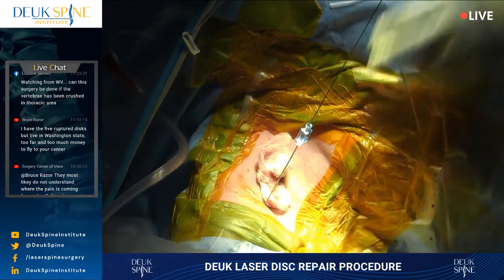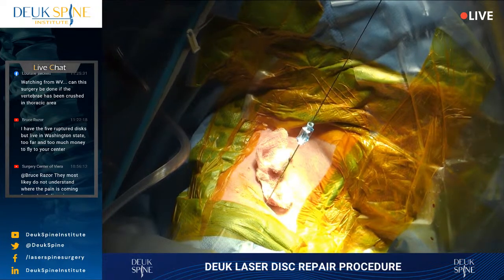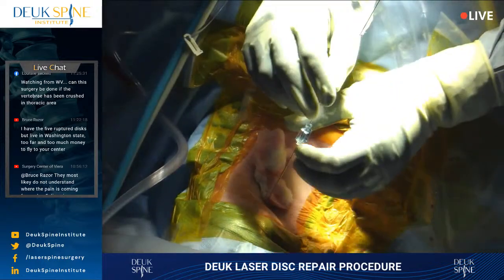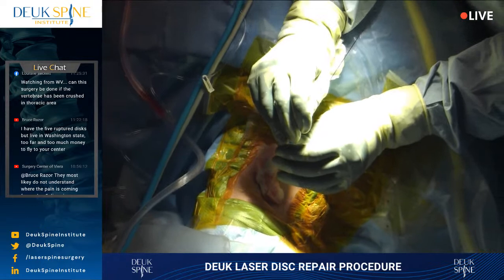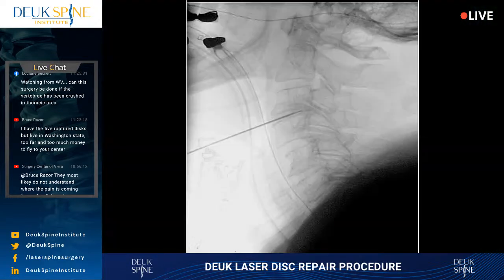All right, we are ready to proceed at C3-4, which is the next level. Shot. Let's make sure our guide wire is in proper position, which it is. Take that scalpel away for a moment, please. All right, now I'm going to leave the guide wire and pull the needle back. Shot. There's a guide wire. You can see it.